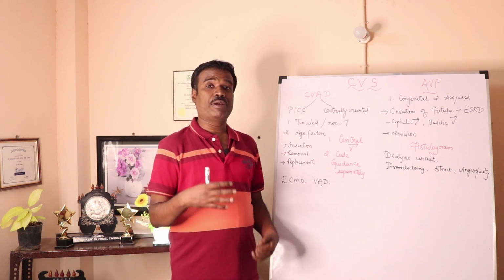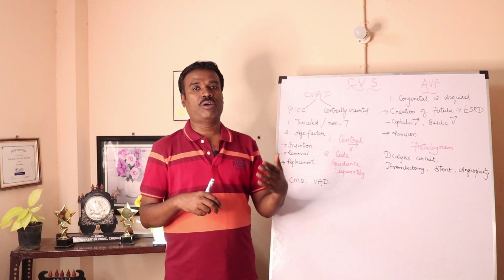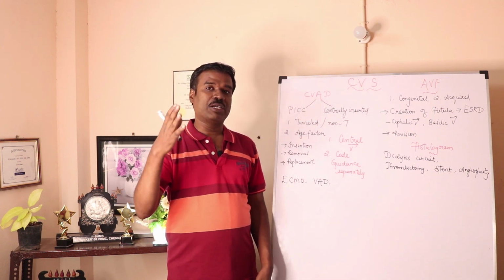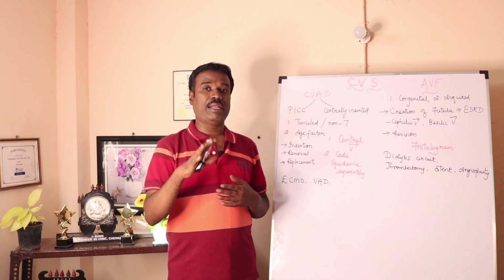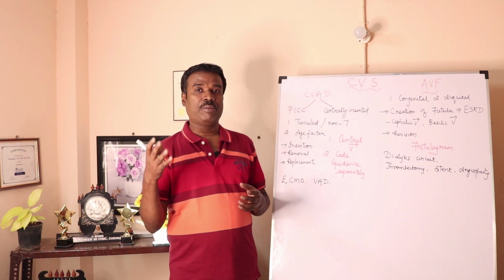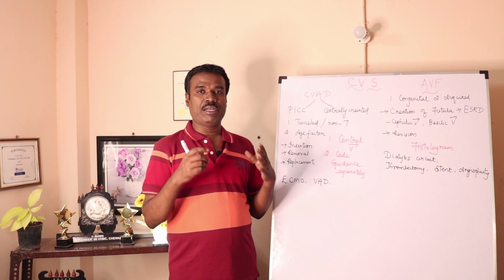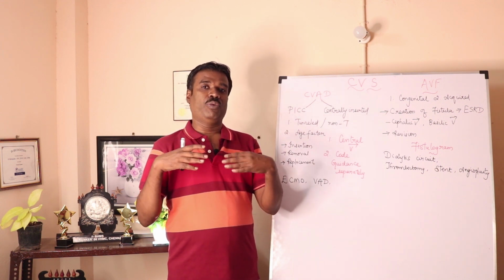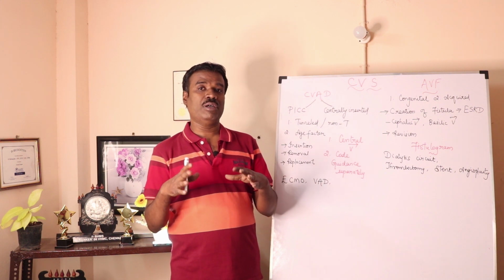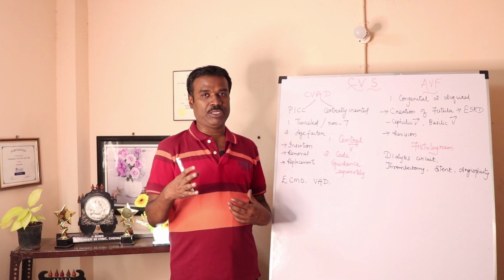Coming to the next topic is ECMO. Hope you all might know what an ECMO is, which is extracorporeal membrane oxygenation, meaning it performs the function of a heart and that of a lung, where oxygenation is being done and at the same time purification is also being done. This procedure is done when the patient is highly unstable and where there is breakdown of all the vital functions. So this would be the last method to keep the patient alive.